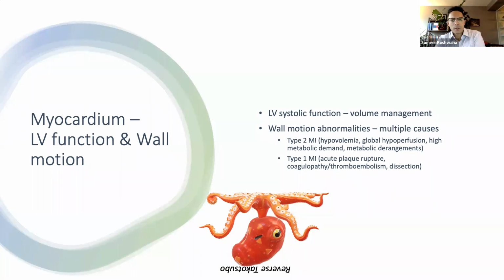So when we're doing cardiac assessment of a trauma patient, obviously left ventricular systolic function is an important aspect of our examination. So we can look at gross LV function overall in order to guide overall volume management and determine if the patient is profoundly volume deplete, or if they have left ventricular dysfunction that can necessitate a more cautious approach to volume resuscitation. And we may detect major wall motion abnormalities on our initial assessment. So the wall motion abnormalities could be pre-existing, or they could be from coronary ischemia related to many different mechanisms in the context of the trauma.